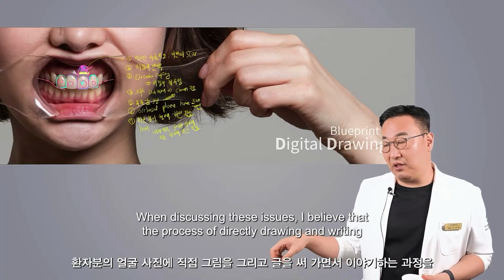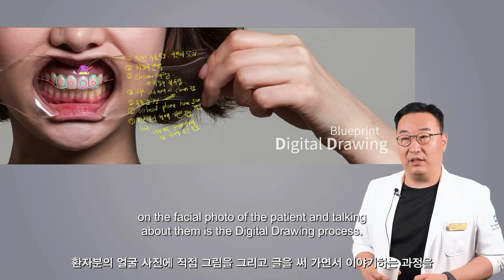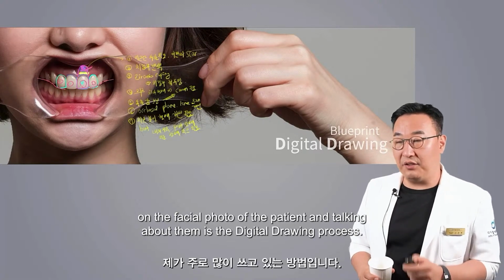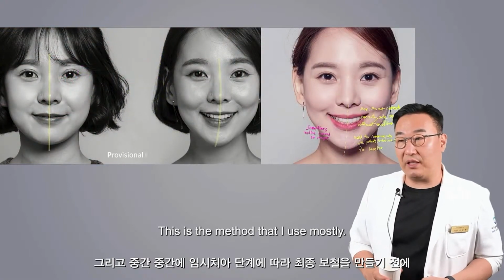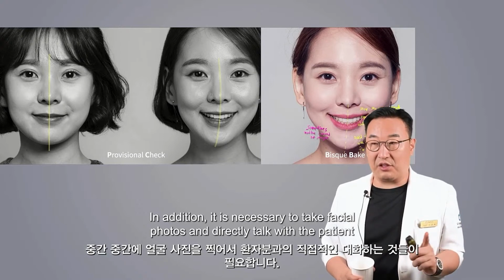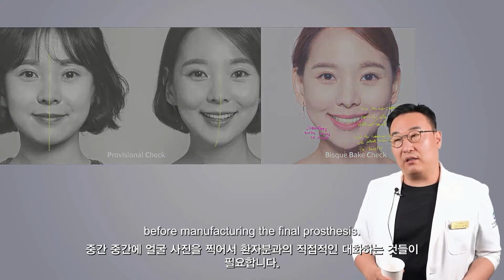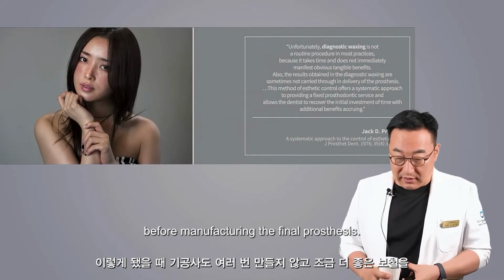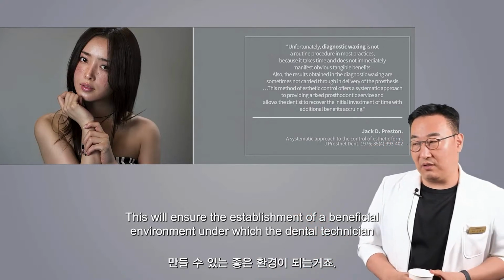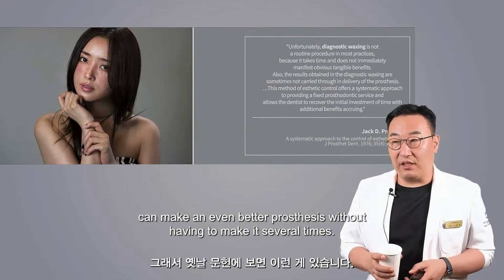When discussing these issues, I believe that the process of directly drawing and writing on the facial photo of the patient and talking about them is the digital drawing process. This is the method that I use mostly. In addition, it is necessary to take facial photos and directly talk with the patient during the interim stages following the stages of the temporary tooth before manufacturing the final prosthesis. This will ensure the establishment of a beneficial environment under which the dental technician can make an even better prosthesis without having to make it several times.